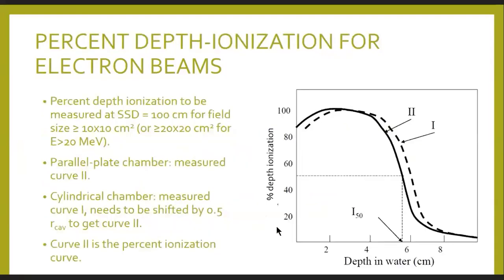So that means we need to measure the depth ionization curve in the beginning. So we measure using our cylindrical chamber or our plane parallel chamber.